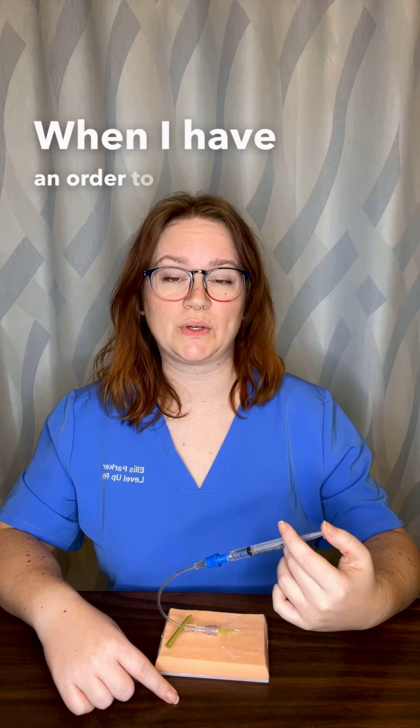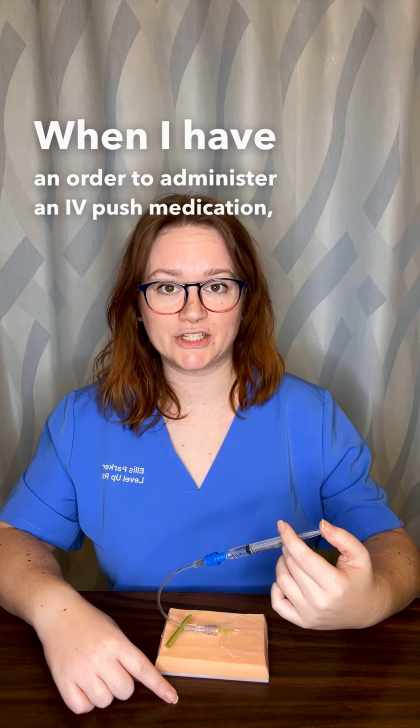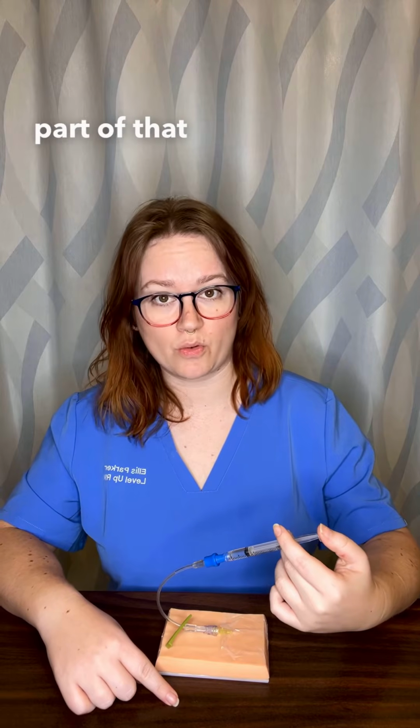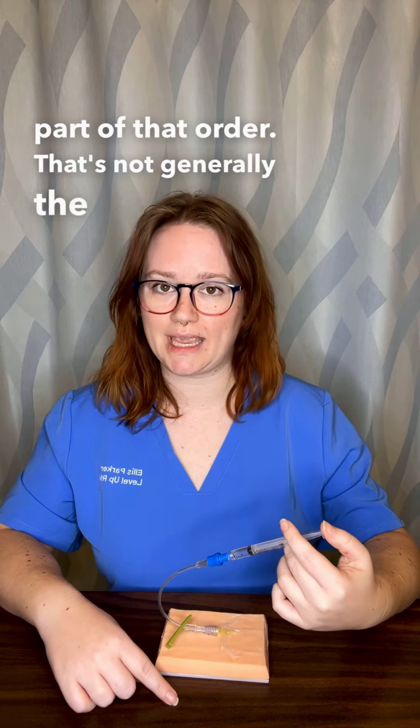When I have an order to administer an IV push medication, you would think that the IV push rate would be part of that order. That's not generally the case.